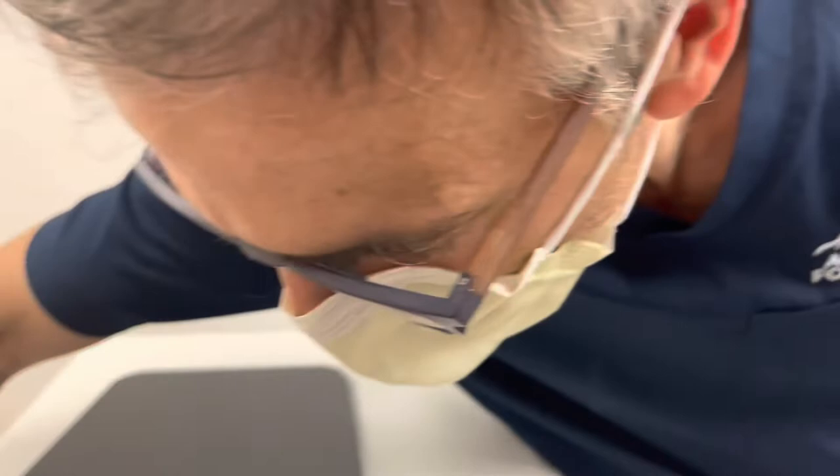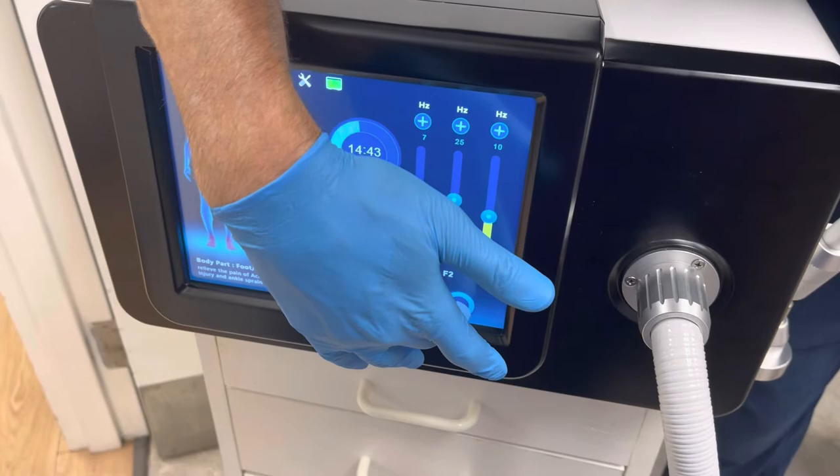Now what we're going to do is put our attachment on to protect the machine and prevent cross contamination — it's disposable. We're going to start the machine. Electromagnetic sequence.